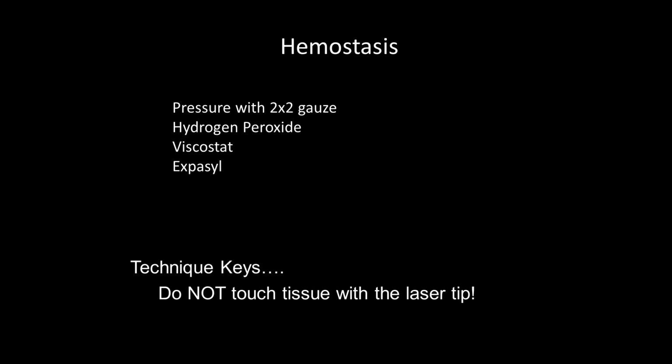But one of the keys, like I said, is the less you touch the tissue directly with the laser tip, the less bleeding you're going to get. And that's one of the benefits of using that tipless handpiece for Pontic sites and finishing. It works really nice because it's totally non-contact.